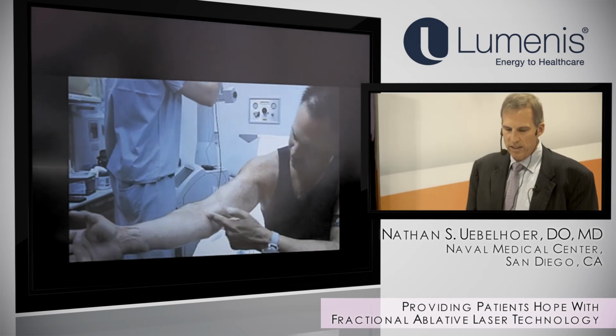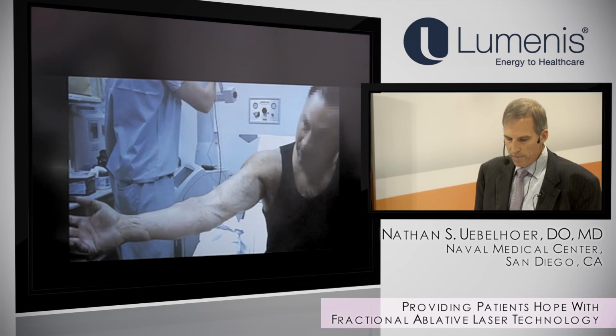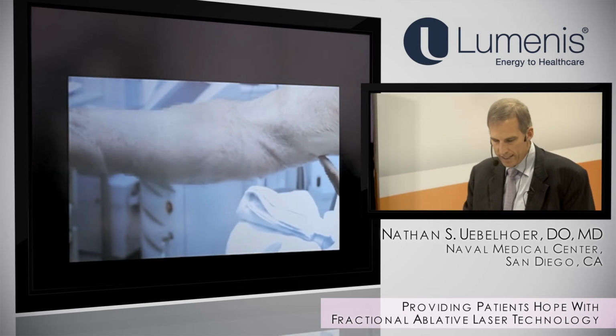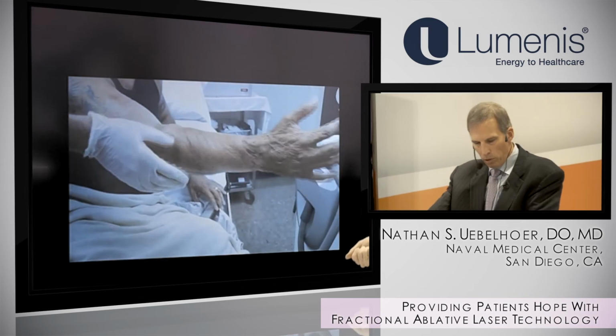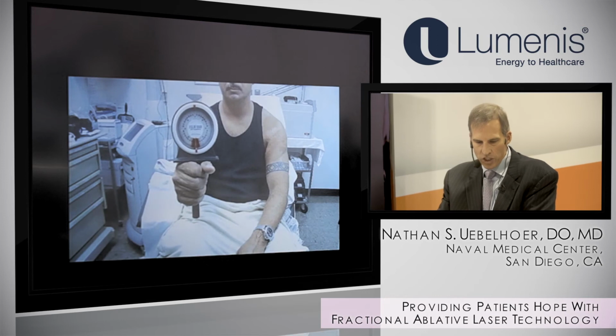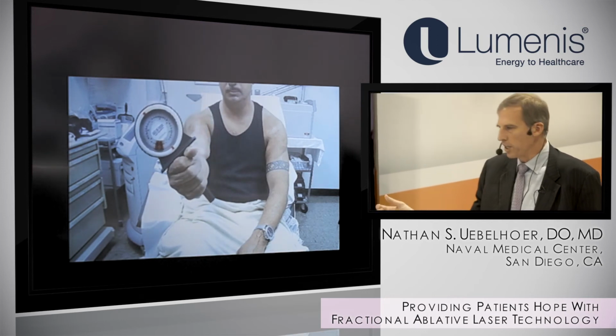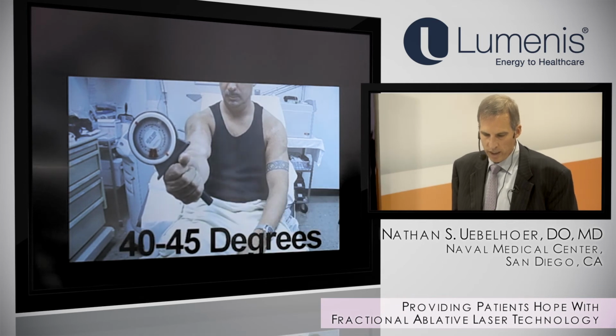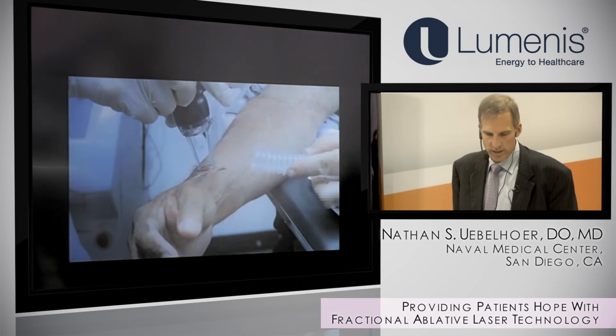Here's a patient who's had this scar since he was a child. He's pointing out the areas where it hurts the most, the tension of the scar. As he turns his arm, we can see the pull on the skin. We can also see the blanching of the skin. It's nice if you have a goniometer to use it pre-treatment, because it really can help you objectively see the difference.